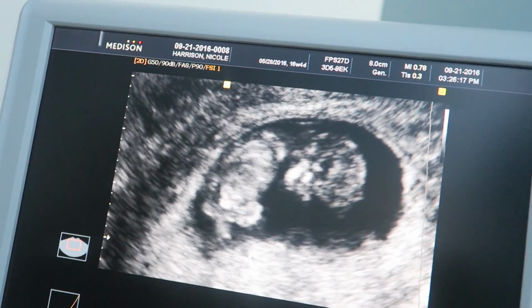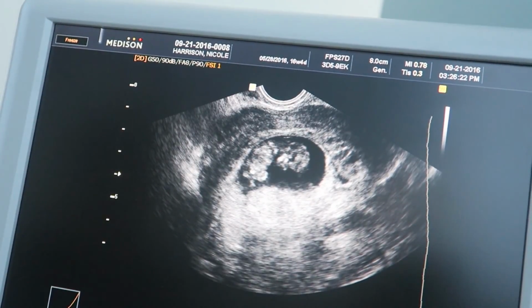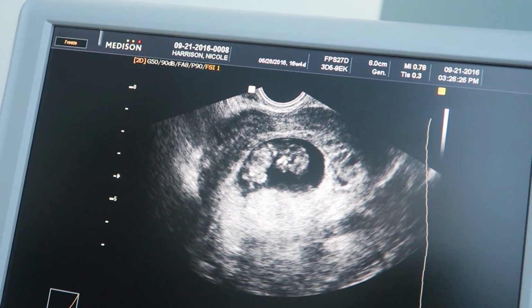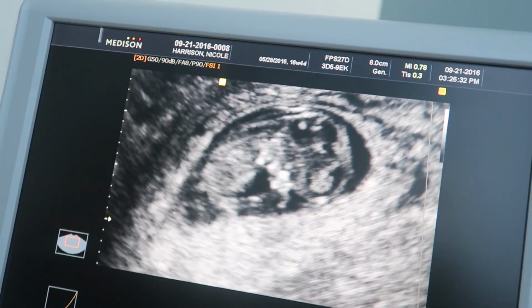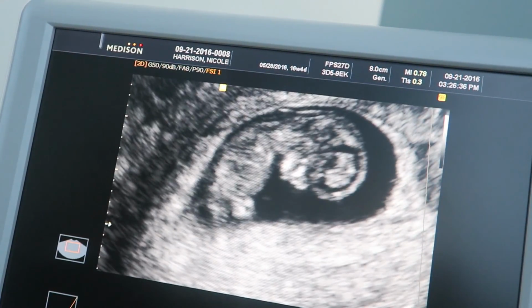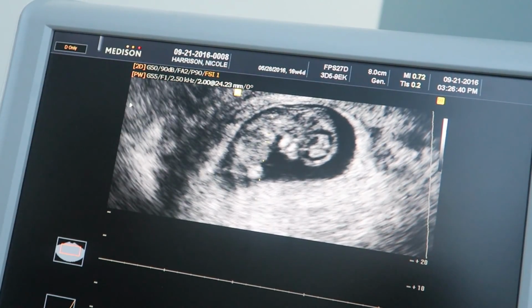Little hand coming up. Again, I'm going to freeze this because what you can see there is the brightness of the jaw and the palate. See how bright they are? And those are the first bones that ossify the earliest. So the brighter, the whiter, the denser, the harder. There's a backwards profile. A little hand going into his face. Okay, so push the right button in the right order so I can get a heartbeat.